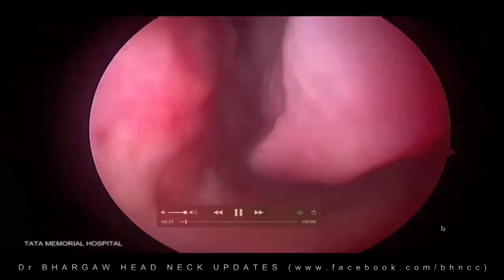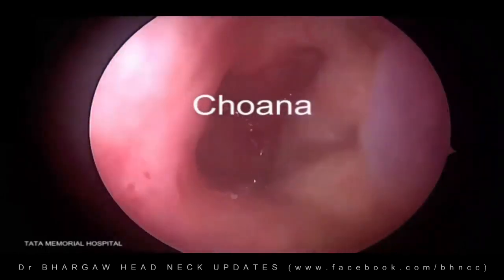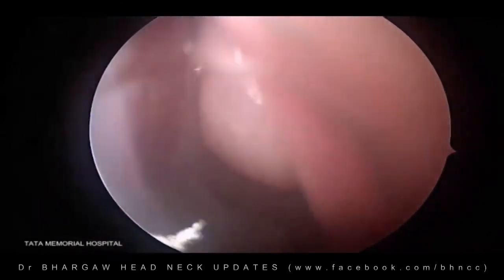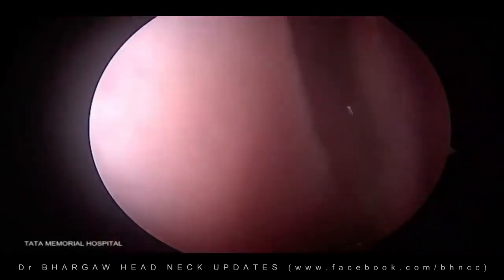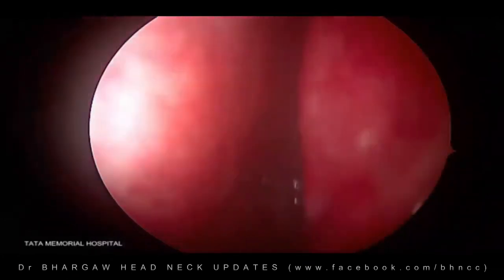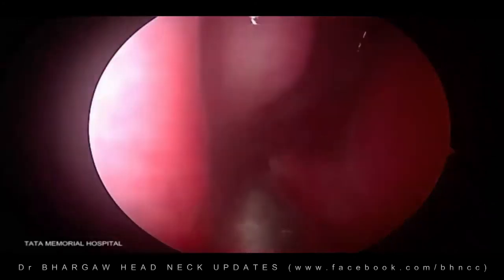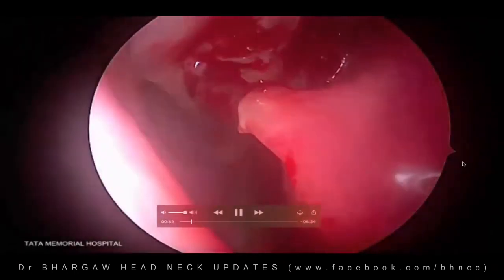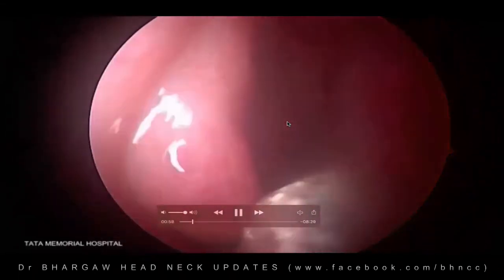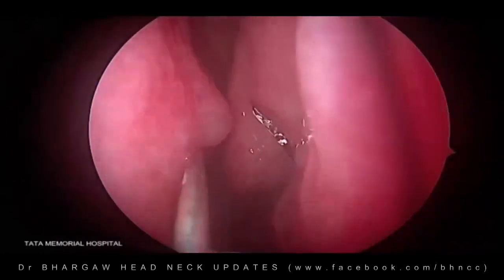Because this was one-sided, we thought we'd use the other side of the nasal septum. We did the initial diagnostic nasal endoscopy on the opposite side, where there was no disease, to confirm before using the Hadad flap. That's the sphenoethmoidal recess, with no disease there, and the roof is normal on the left side. On the right side there's a spur, and then there's disease. You can see the tumor there, and that needs to be removed. The septal cartilage was not eroded, so that will be the margin.